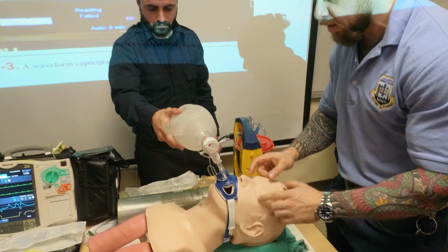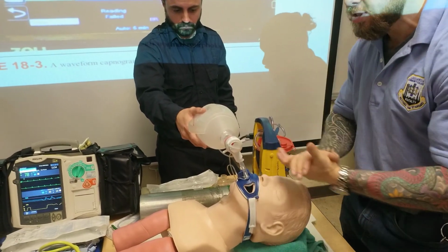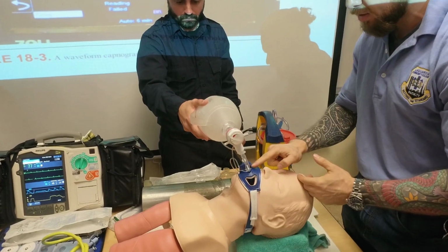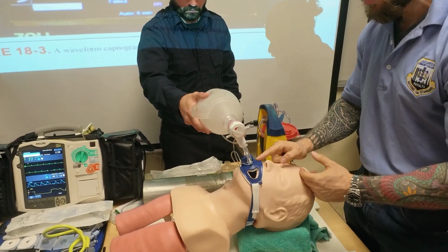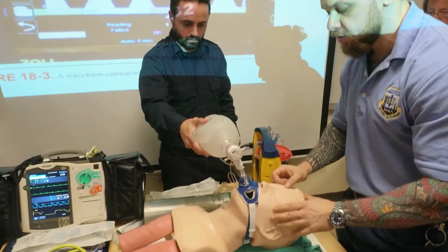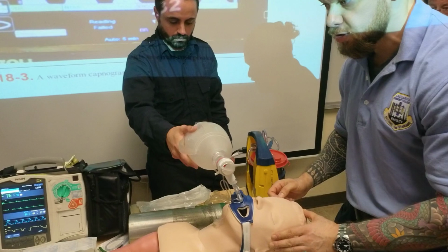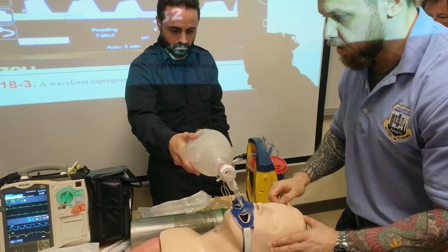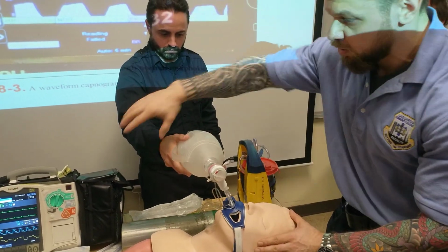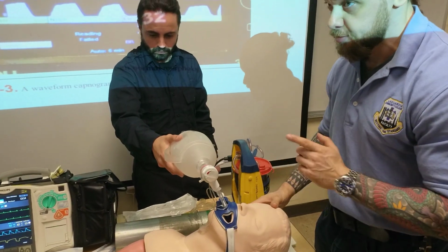Instrumenting the airway, right? Go by structures. Epiglottis first, vallecula next. Then you see the vocal cords, you put the tube in. Look at the number, how far down you're going, right? First confirm, secure, reconfirm. And then the instructor is going to tell you, if they have some secretions coming in, they're going to show you how to suction, right? I don't want to spend time on that. When the patient is being transported on this, all of this is there. Any questions? Ask me now, any questions?